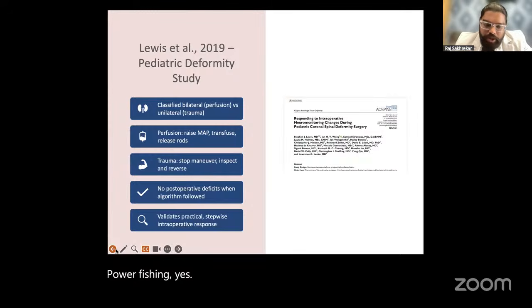to ischemia of the spinal cord, leading to the bilateral or global intraoperative neuromonitoring change, leading to the weakness or symptoms because of that. And the other is because of the trauma or the mechanical pressure. Either there is an impinging screw, or a laminectomy defect while operating, you injure the cord. So they divide into perfusion injury versus mechanical injury.